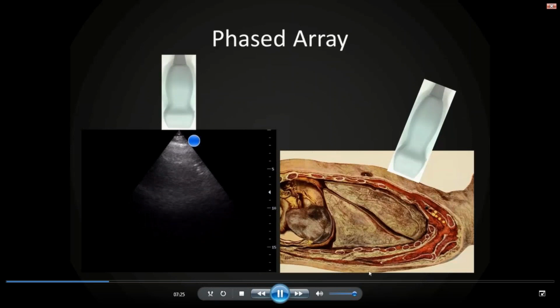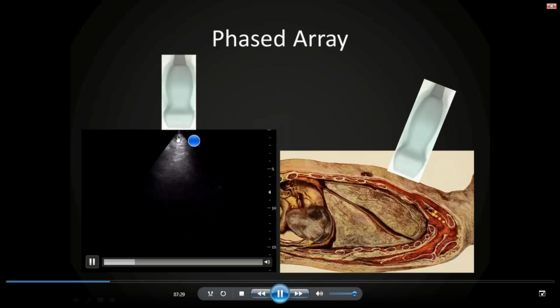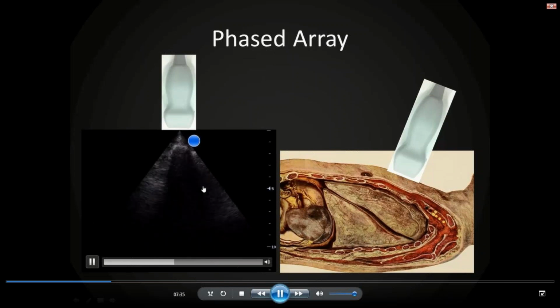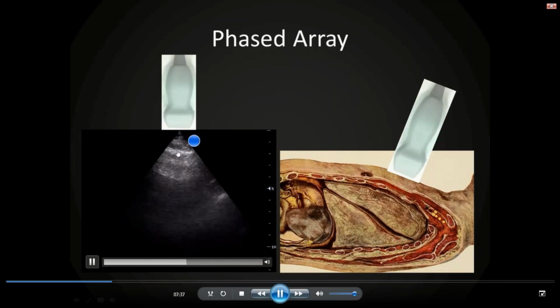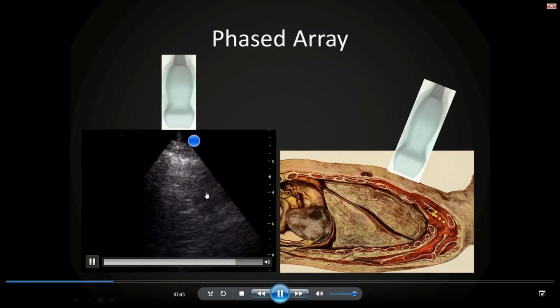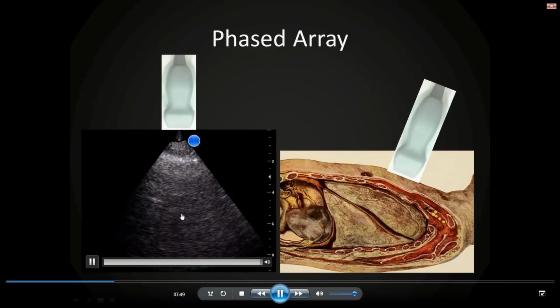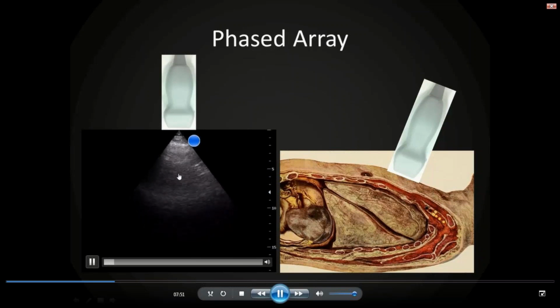There are different ultrasound transducers we can use. Phased array is commonly used, but the pleural line isn't seen quite as well. Our depth is 15 centimeters. If we change it to 10, we see the line a little bit better. I often have trouble making this out without glasses on even then. You can change the depth even further. And now we can actually start to see sliding. But these type of transducers are good at penetrating farther, and they have other uses that are excellent in lung ultrasound.